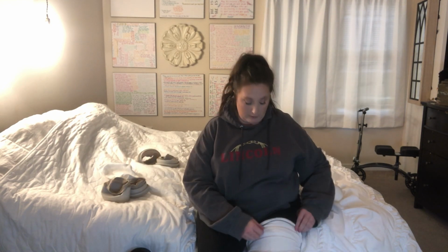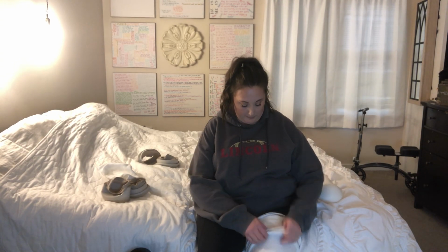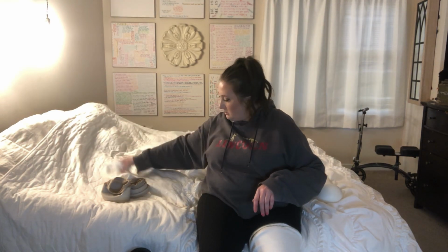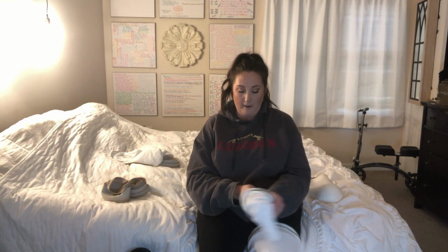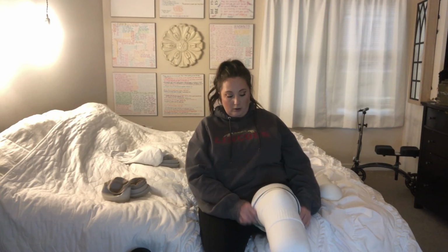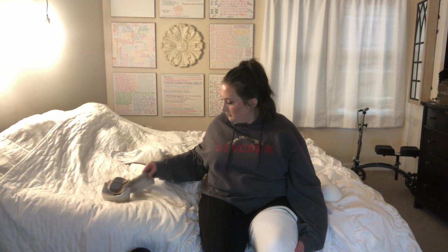I don't even know what I have on right now. 5, 3, 1, 1. So I'm going to take these off. I'm going to put on, so now I have 5, 3. I'm going to put on another 3, but only on my calf area. So I'm going to leave it up here, right here, and then leave this area only at 8 ply. And put on the thicker ring. See if that works.